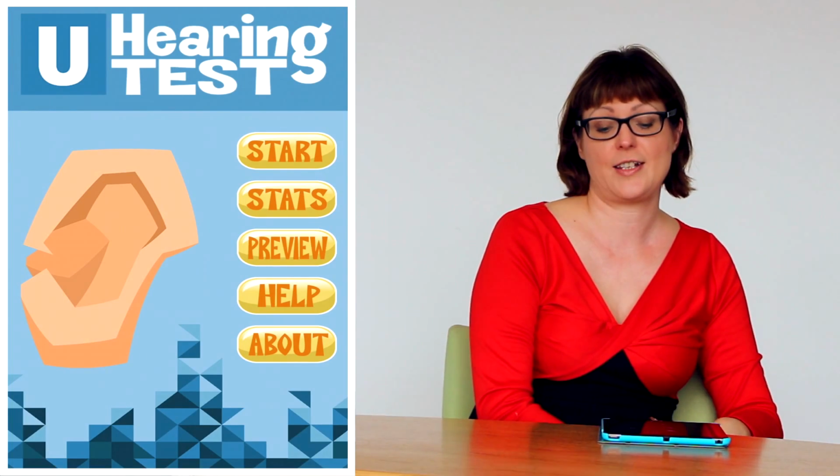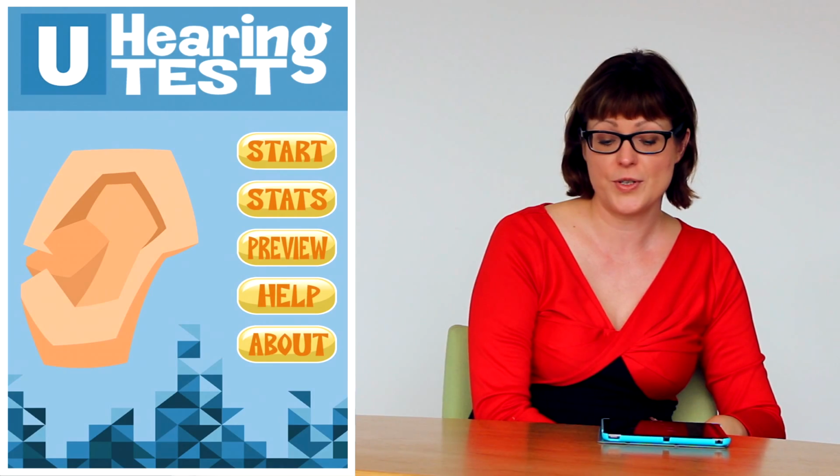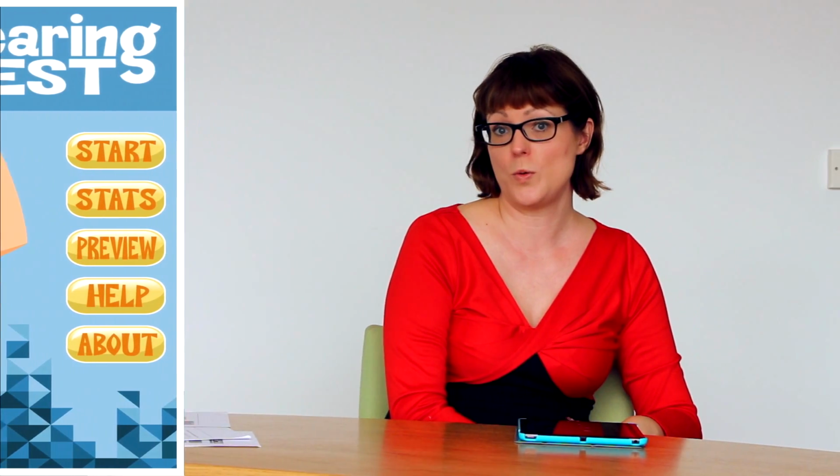But ultimately, it's that simple to use. It really is a great tool if you have concern about your own hearing loss or the hearing loss of someone else. We actually had a pretty revealing experience in the office when we were experimenting with these tests, and it did encourage some people to go and seek medical advice. There are a range of other tests out there. Some will give you your hearing age. So I actually discovered myself that my hearing in one of my ears is probably 10 years older than what it should be, and they are worth looking at.